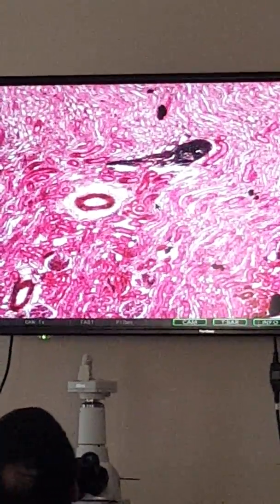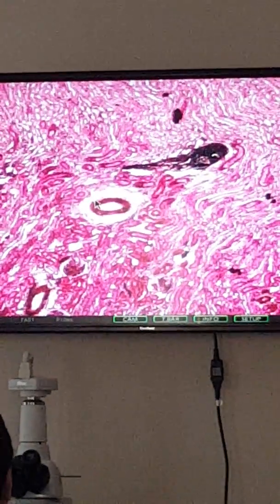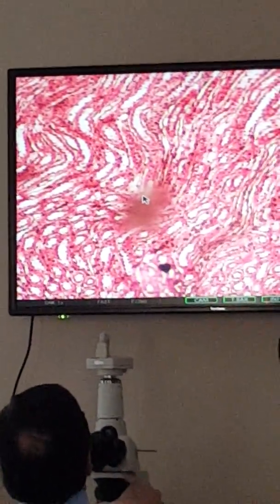Let's get the feeling that I can see an internal elastic membrane. I don't know if we can, but let's get the feeling that you can almost, yeah, do you see it? Remember that arteries have internal elastic membranes. It's right there. You see it? Mm-hmm. Yeah, give me some feedback, people. Otherwise I feel alone in this world. Okay.